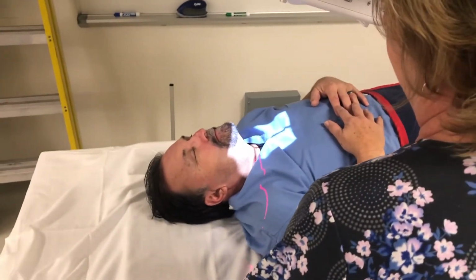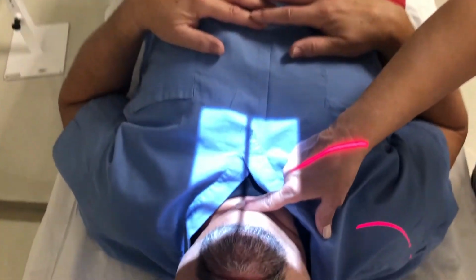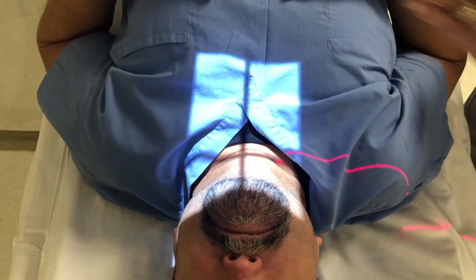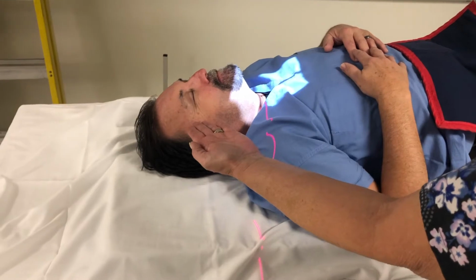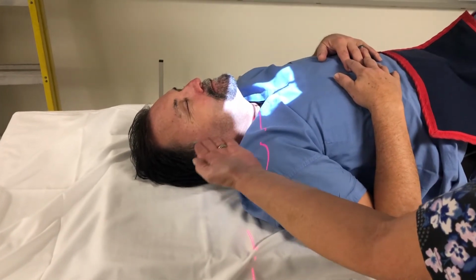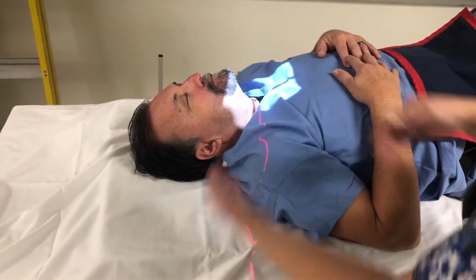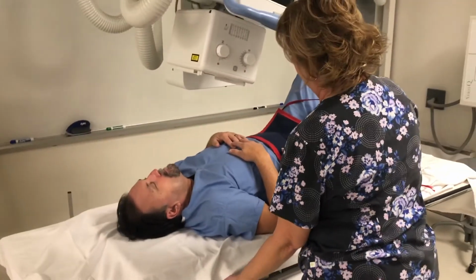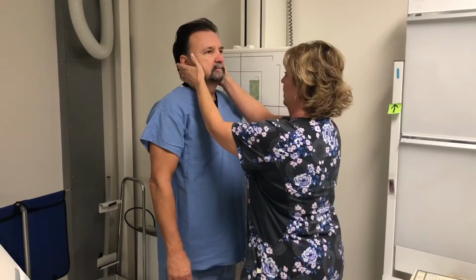And I'm roughly centering at the thyroid cartilage, which is his Adam's apple. It's also about the level of C4. So as it's passing through, it's hitting C4 and exiting. The reason we've got the curve is because the cervical spine has a lordotic curve to it, and as it curves, I'm trying to match that curve with my central ray. So that is my AP cervical. My patient shielded, I would have him stop breathing and expose.